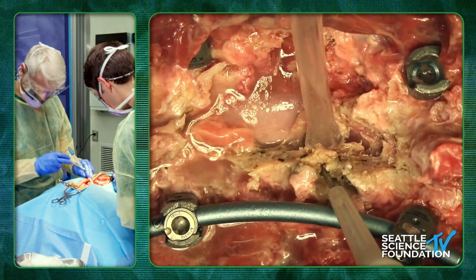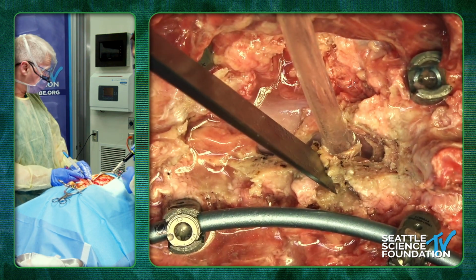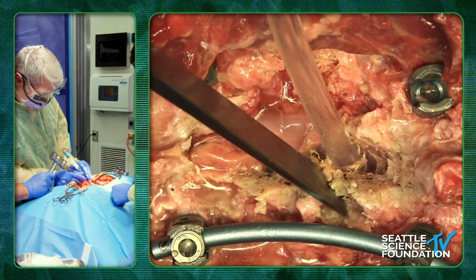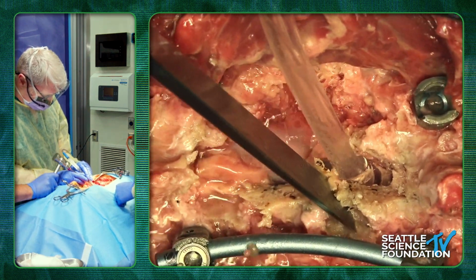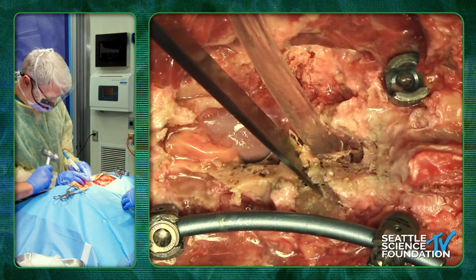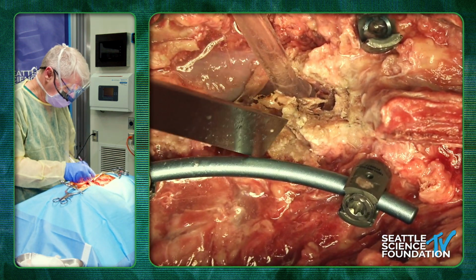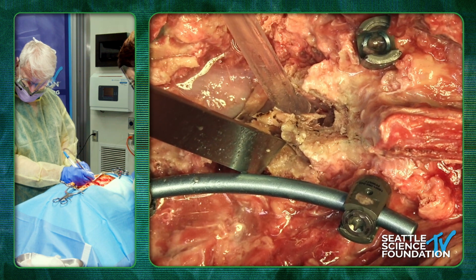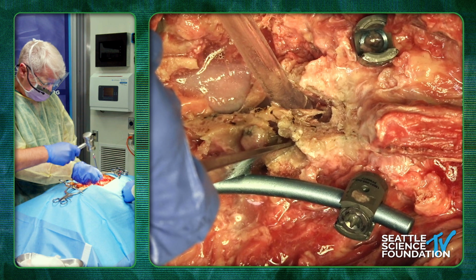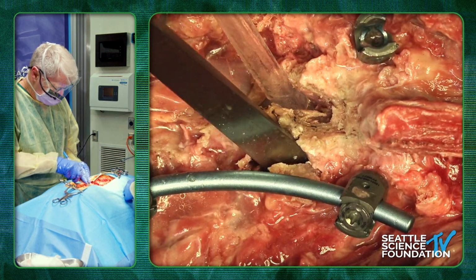Okay, you through? Okay, and we'll just take a hammer. Here, hammer me there. Okay, and again. Okay, yeah, keep going. Okay, so that's the superior facet from the pedicle. Here, one more time, a little shot. A little more. Okay.